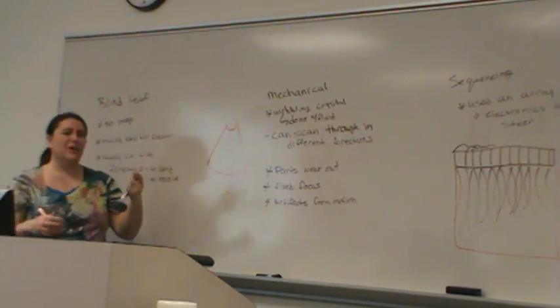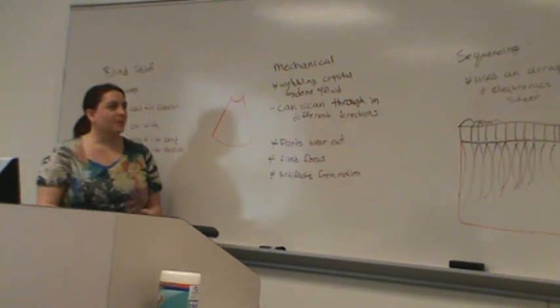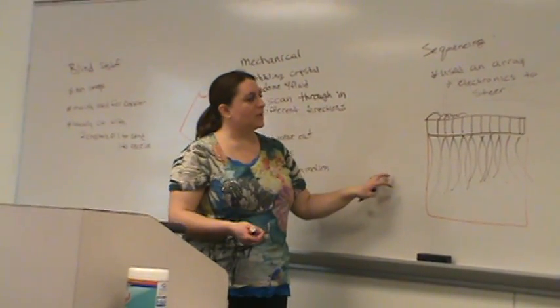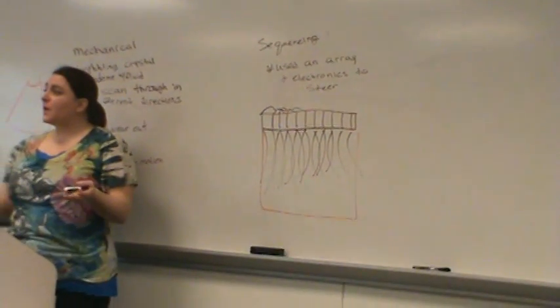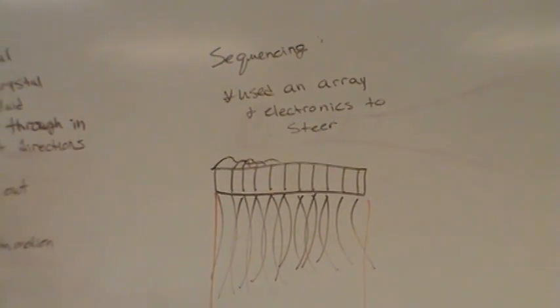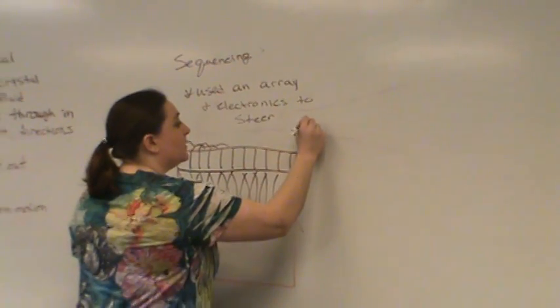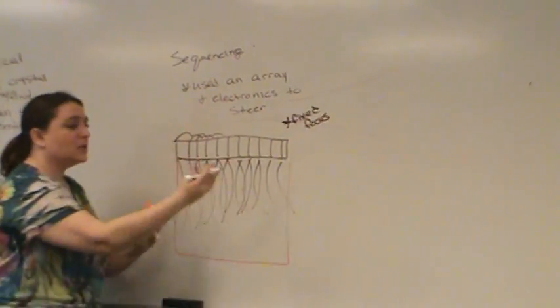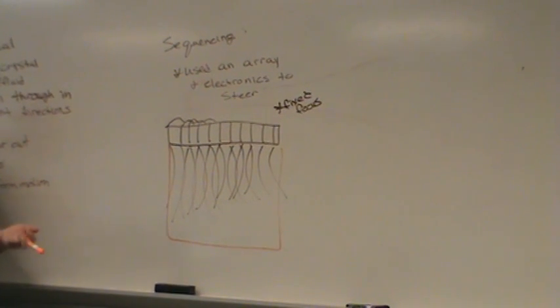So while you think, well, why do I have to know what shape the image was? They ask questions about that. Okay, so these kind of more old-fashioned sequencing transducers, that's what they did. When they were first coming out with this, that's all that these guys would do. They had some of the same limitations as the mechanical transducer. These guys had a fixed focus, and we didn't really have any additional steering capability. They saw straight ahead. So it had some limitations.